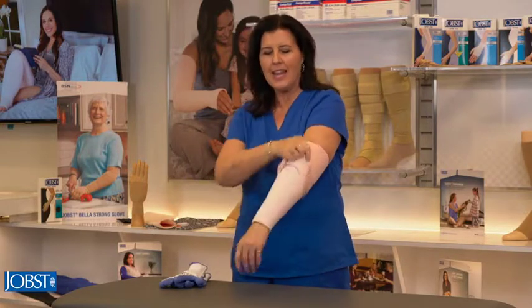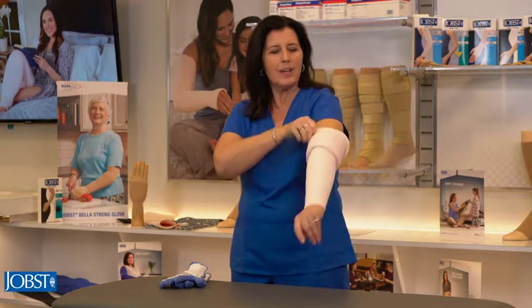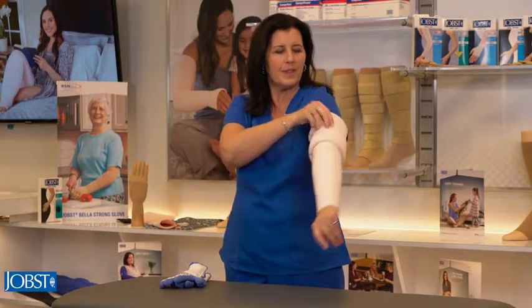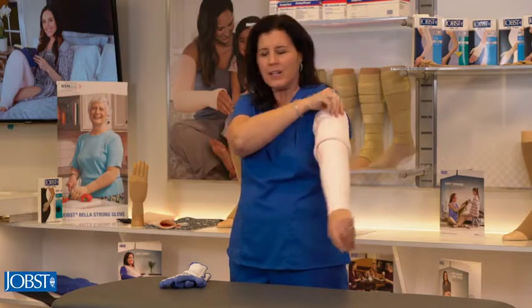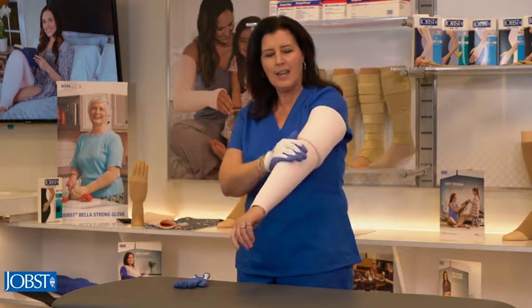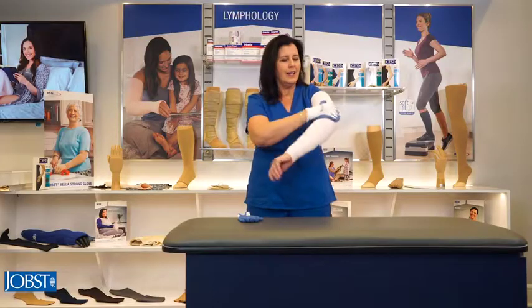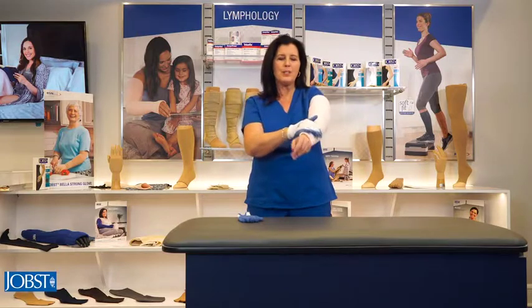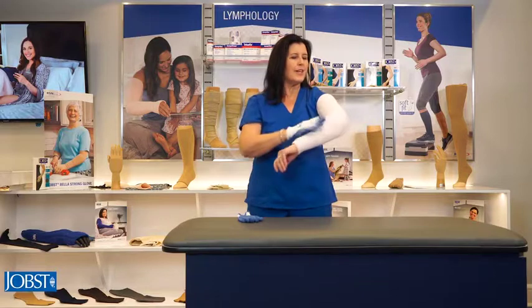Take off the glove and then fold the garment over and move it up the arm. Don't worry if you have a little excess fabric — put the glove back on and move that fabric around. Compression garments have a memory to them, so as you move it around it will take up the excess.